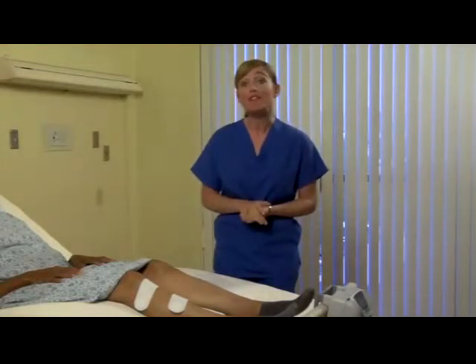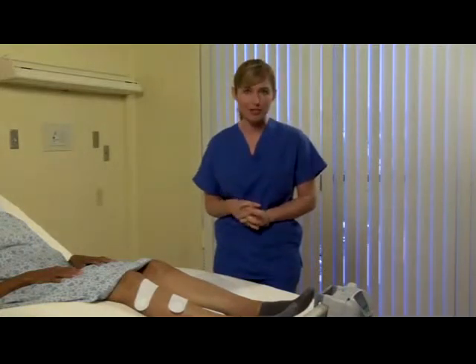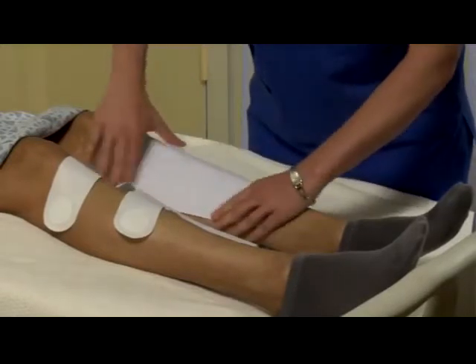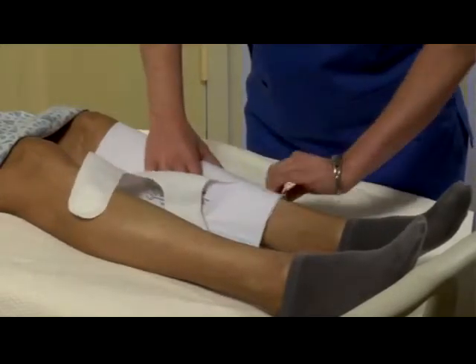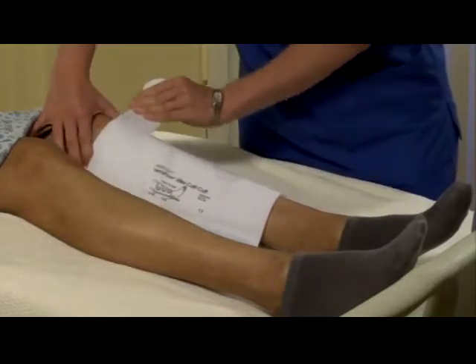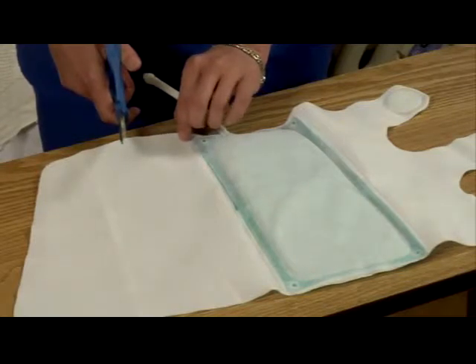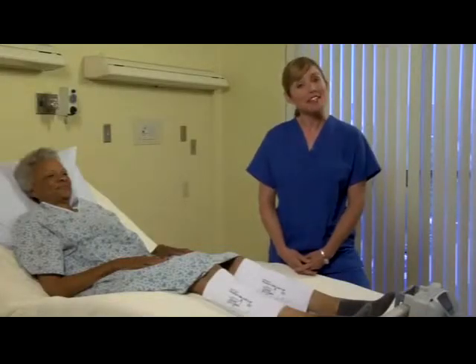In the operating room, it's advised to place the air cell in an anterior position to minimize movement during the surgical procedure. Wrap the cuff around the leg and secure the cuff straps so they're snug but not tight. The cuffs are one-size-fits-all and may be trimmed for a more snug fit.